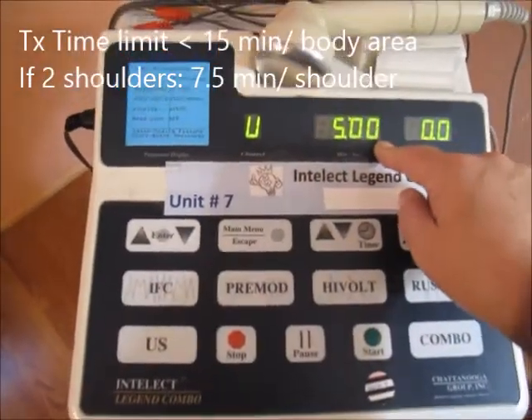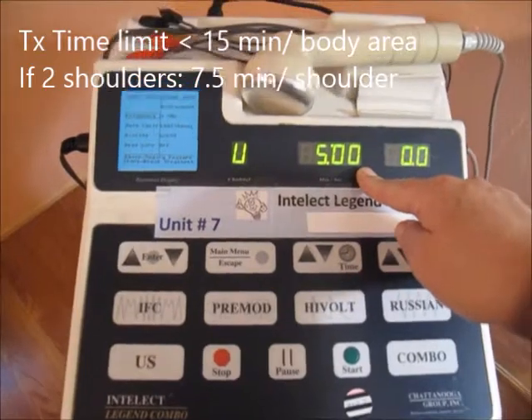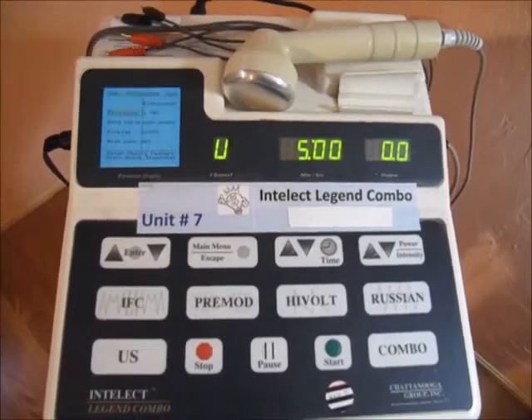The time that's defaulted is 5 minutes. You're allowed to use as long as 15 minutes per body area. So if you're doing an upper body like the shoulder — 2 shoulders — do 7.5 minutes per side.